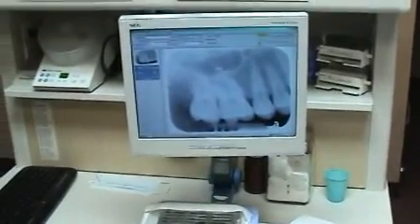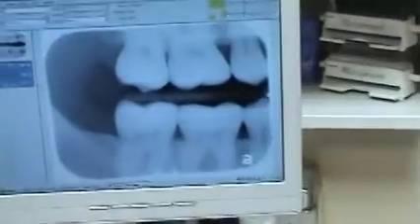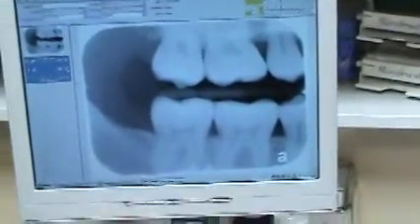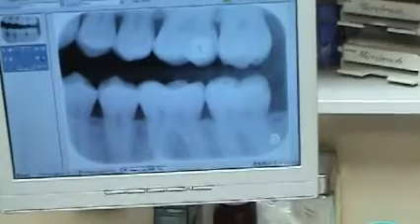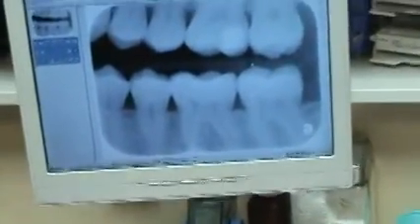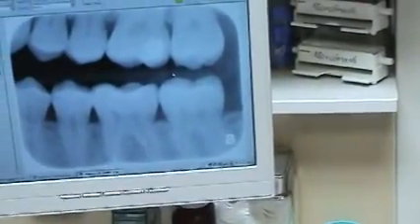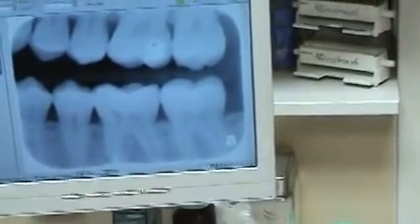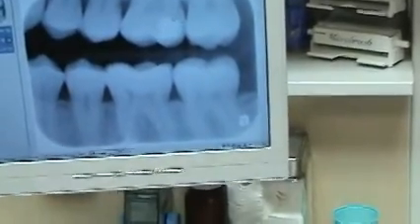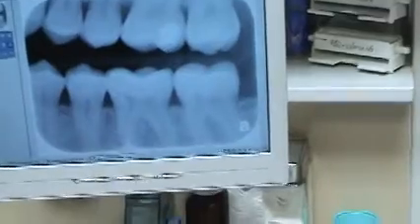So we'll go back over here and we'll look at some other different pictures. Okay, Kathy, I think it's this tooth here. So, Sister Anderson takes very good care of her teeth. In her whole mouth, she only has 1 cavity, and it only had 1 filling. Her whole life. Yeah, that's it. Wow. So she takes good care, and that's what that looks like there.